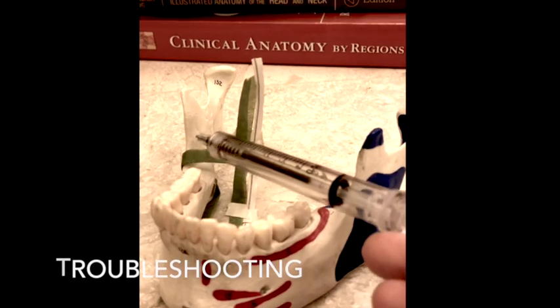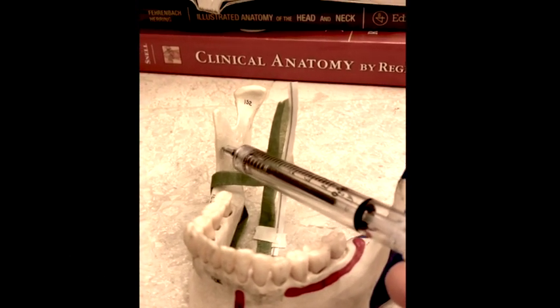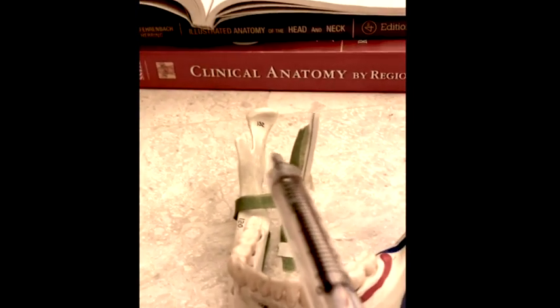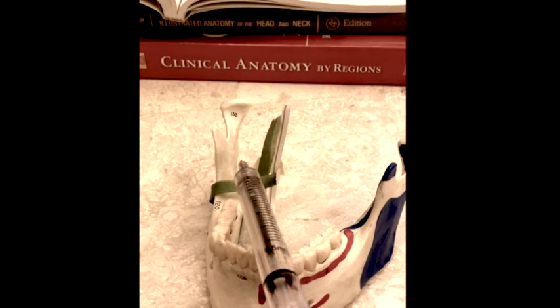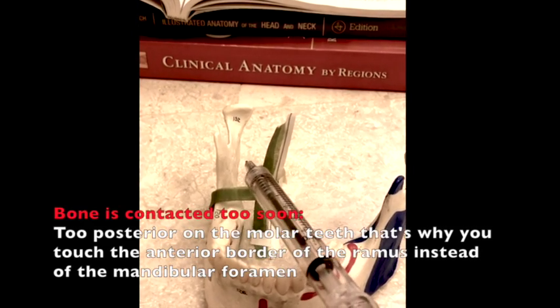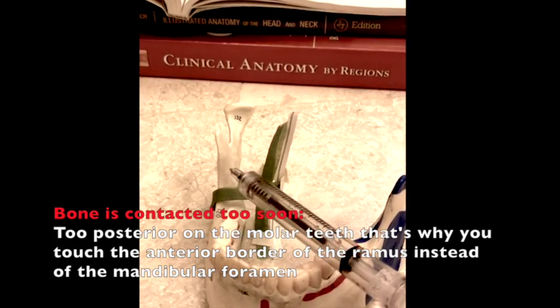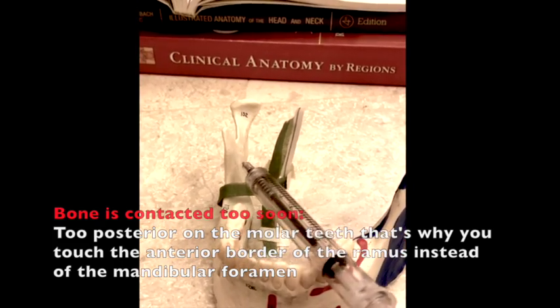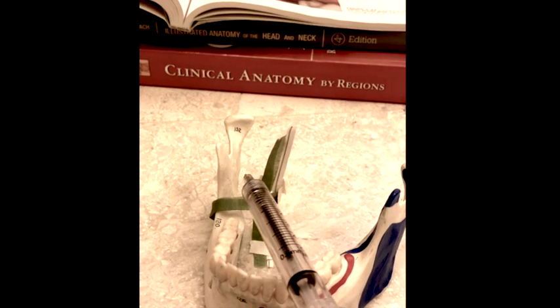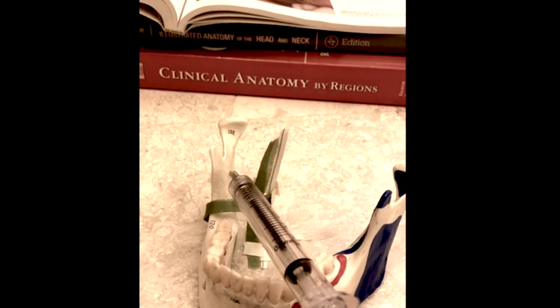What if you touch bone very early? Contacting bone too early means you are too posterior and need to go more anterior. All you need to do is withdraw your needle slightly to redirect it — you don't need to withdraw it entirely; you can just redirect it inside the tissue.